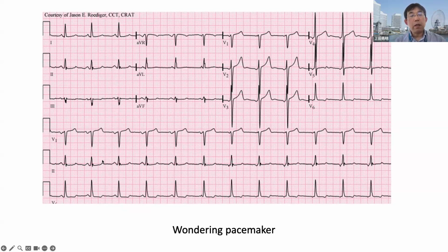So we can see at least three patterns, plus, plus, minus, minus. But still, it has normal conduction. That's why the QRS is maintained. We cannot find any difference in conduction between each pattern, which is conducted by these three different types of P wave.